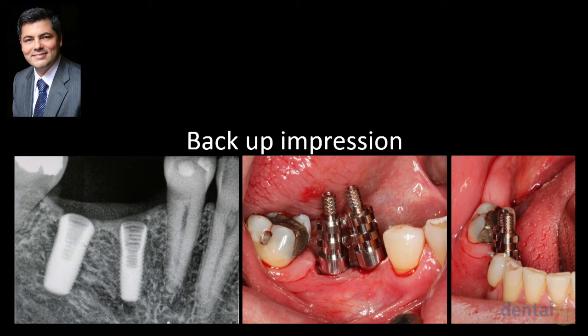Anytime that you are working with intraoral scanning and implants in immediate loading, you're going to do two things. You're going to do your intraoral scanning, but you're also going to take the impression so you can implement what? The quick model, in case your intraoral scanning is driving you crazy. If you try to get it and try to get it and try to get it, and you keep on getting blood and you don't get the finish line, just go into the quick model. It's going to be faster than fighting, or faster than trying to coagulate the area.